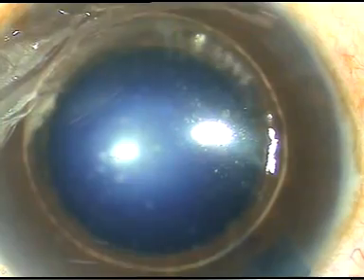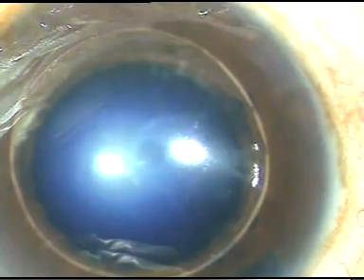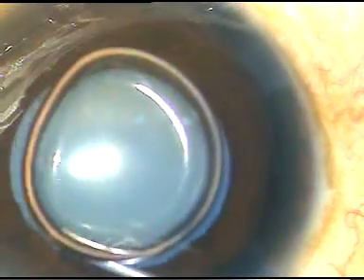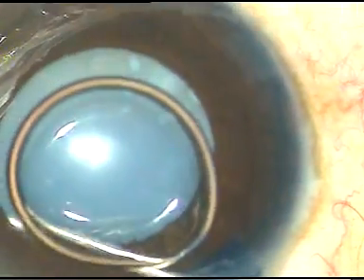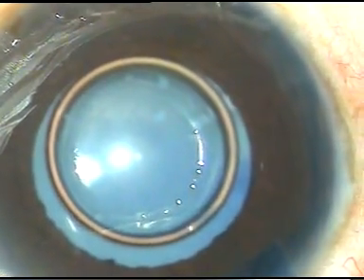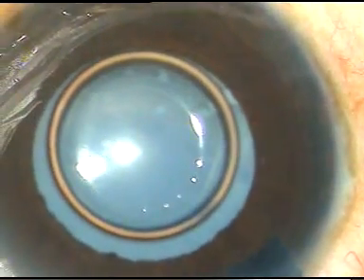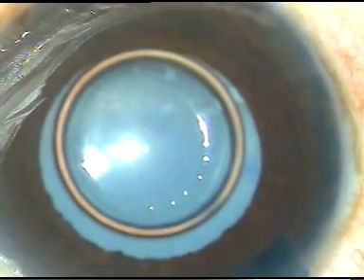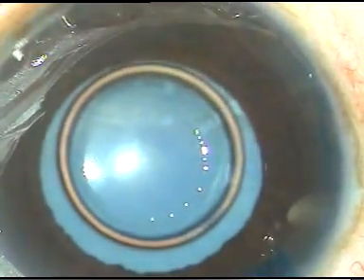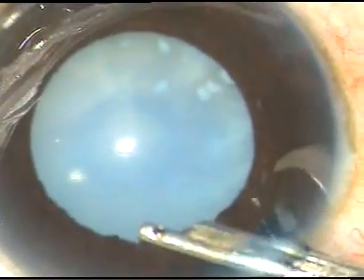I am going to use adrenaline to see if the pupil dilates a bit more. In this case, the pupil has dilated to about 5 mm or 6 mm. With adrenaline, it has dilated a little more, maybe 6.5 mm. And if this dilatation remains throughout surgery, there should not be any problem.